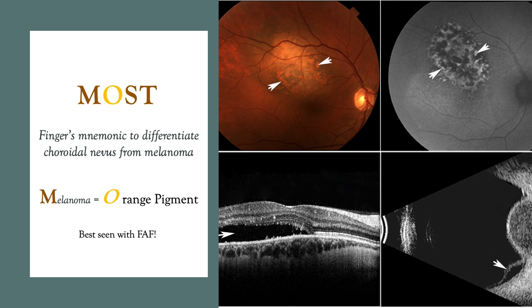On the top left, you see gross orange pigment. It's not hard to see that with indirect ophthalmoscopy and color imaging. However, on the top right, you can see that fundus autofluorescent imaging highlights and hyper-autofluoresces the orange pigment. When you have small amounts of orange pigment, sometimes the fundus autofluorescent images will help you find and diagnose its presence.